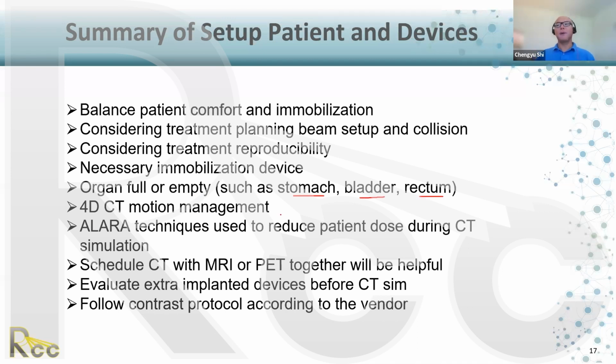For the CT motion management: free breathing, gating, or compression, as low as reasonably achievable. So do what you can. Do not do what you cannot. That sounds complicated, but that's the best that you can do for the patient.